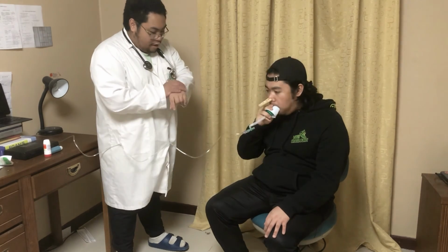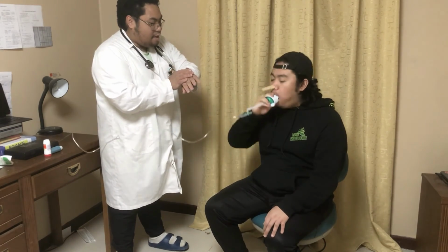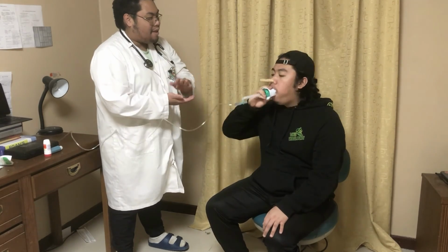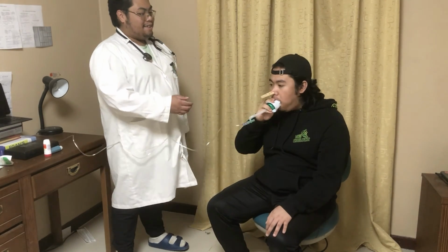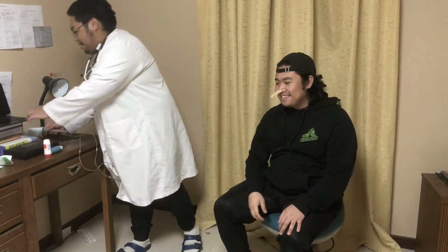Inhale, exhale, inhale, exhale, inhale, exhale. Okay, that's good, sir. That's good, that's good. Good results. Okay. How are you feeling, sir? Are you feeling alright? Yeah, kind of alright. Okay. It's good to hear.